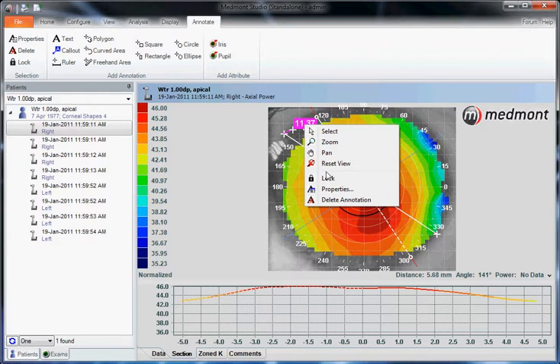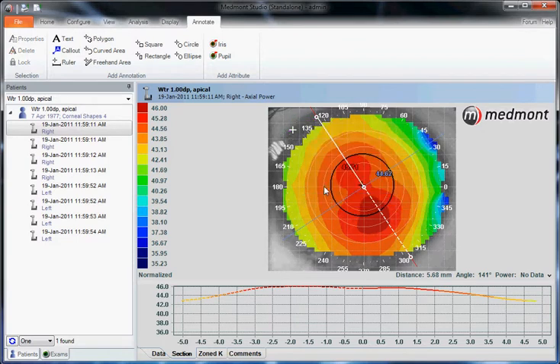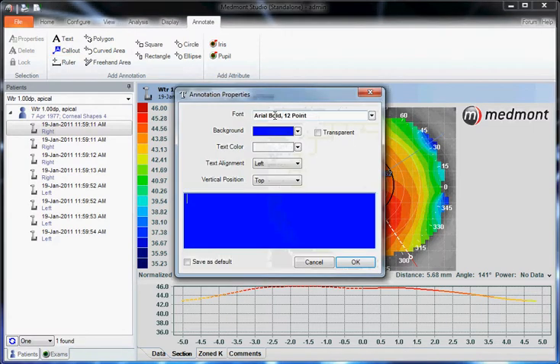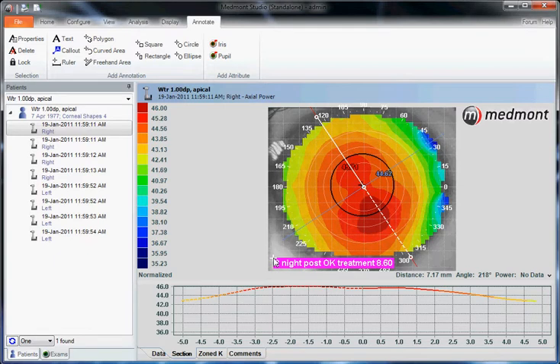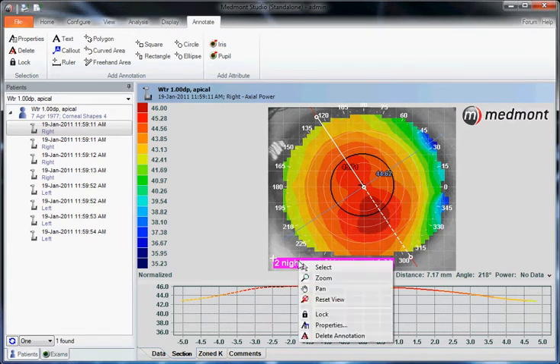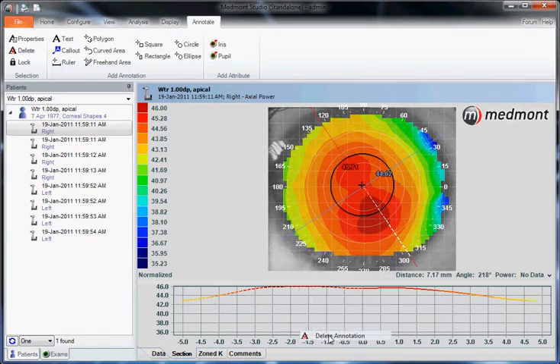If we right click on top of it, we can delete that annotation. If we wanted to add a text box — to note this was two nights post ortho-K treatment with the 860 lens — we can add that. We can move that to a different position on the map so it's not in the way, or right click and delete it.